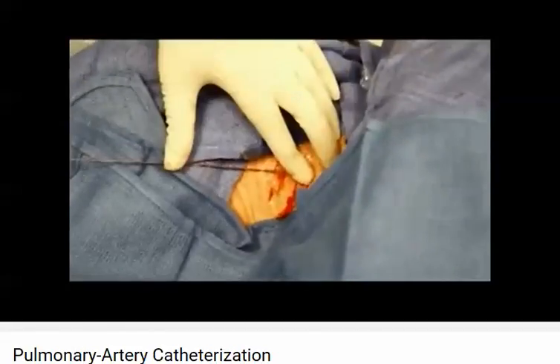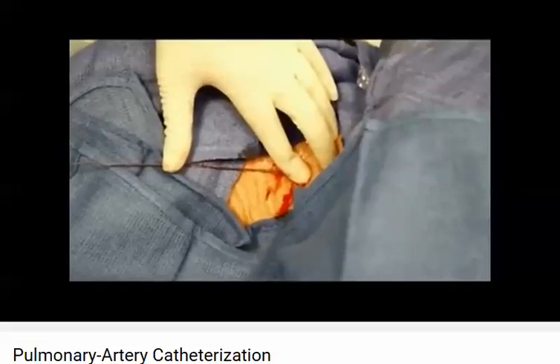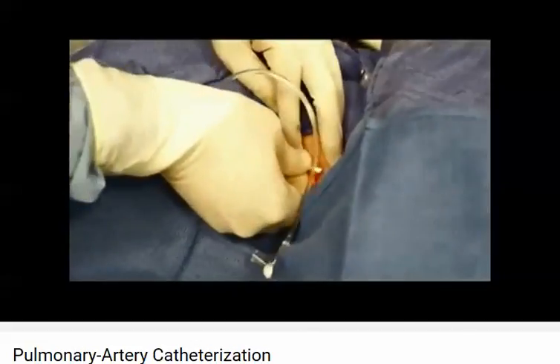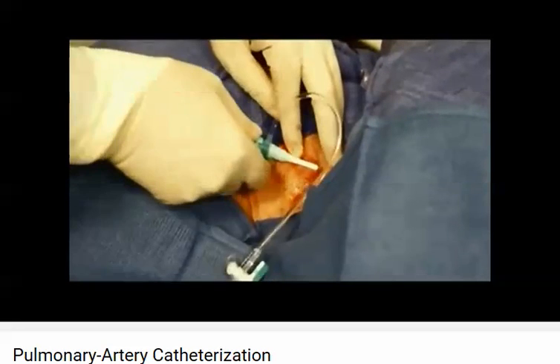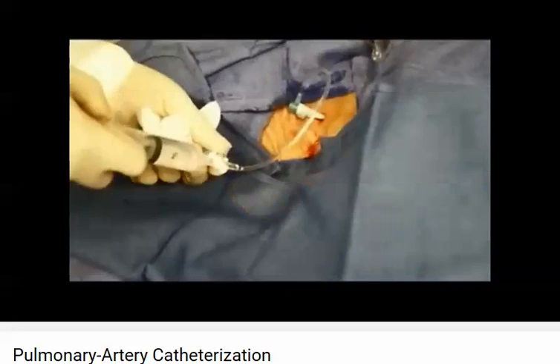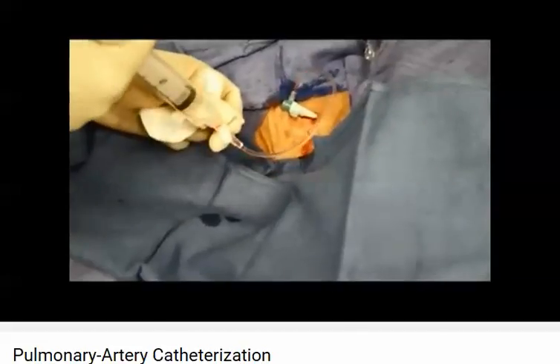While stabilizing the guide wire to ensure that it remains accessible and does not embolize, insert the sheath and obturator over the guide wire until the hub of the sheath fills the incision. Remove the guide wire and obturator, leaving only the sheath. Using a sterile flush, test the port to ensure adequate blood flow.